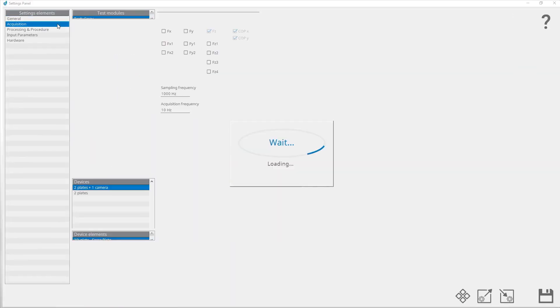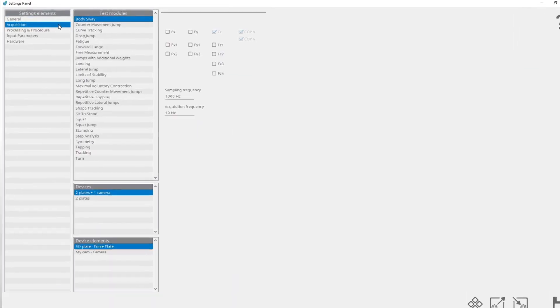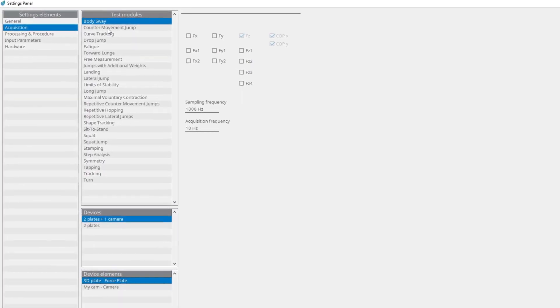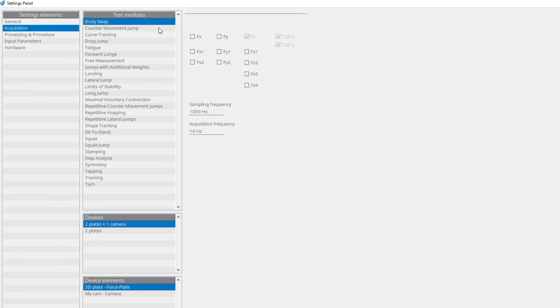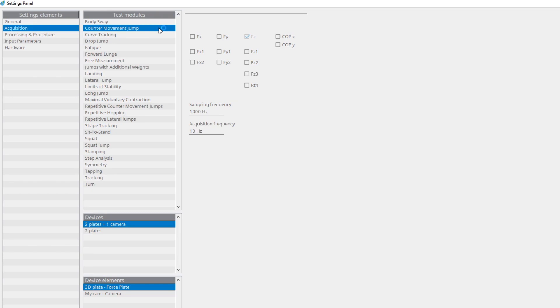Under acquisition, you can select which channels you want to acquire with the force plate, and set the frequency of data acquisition from the force plate for each test module separately.